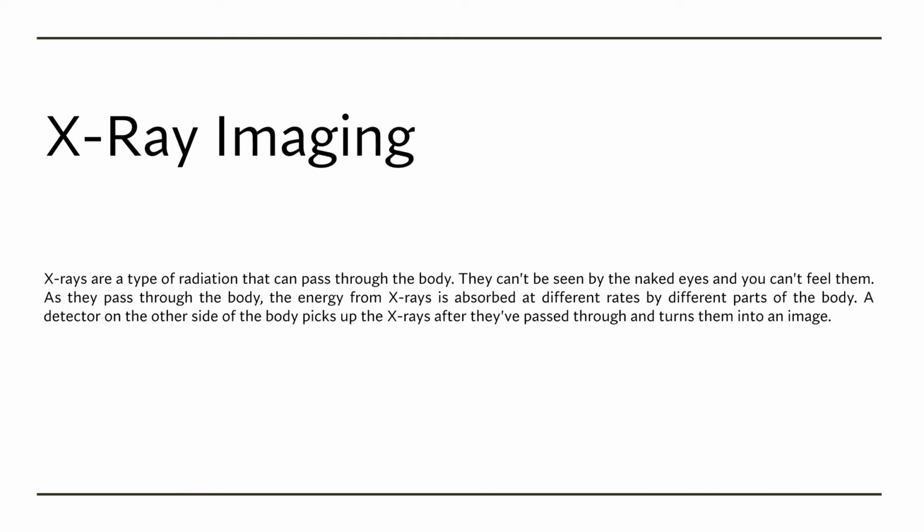Assalamu alaikum. My name is Ahmed Musulmani, and today I'm going to talk about X-ray imaging and discuss the hospital's requirements of specifications for the devices we want to buy. First, X-rays, as we know, are a type of radiation that can pass through the body.